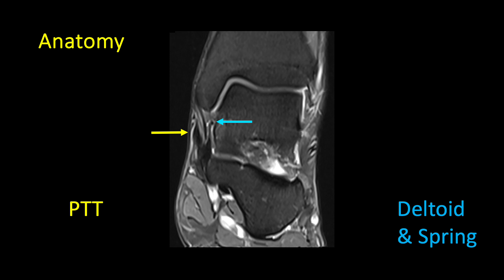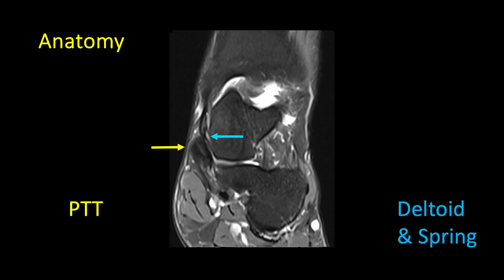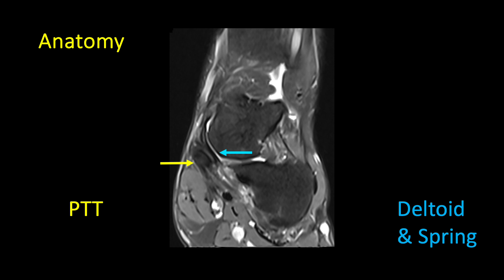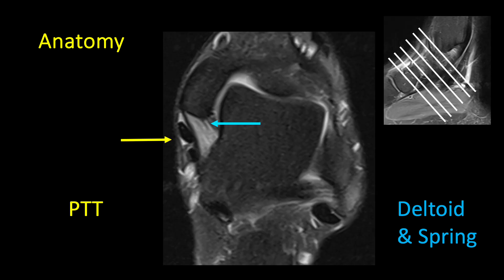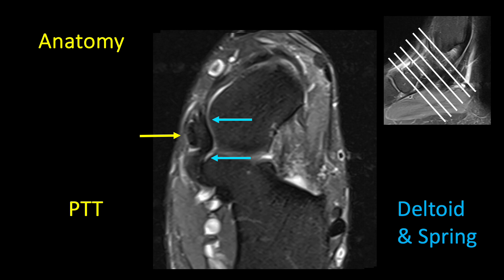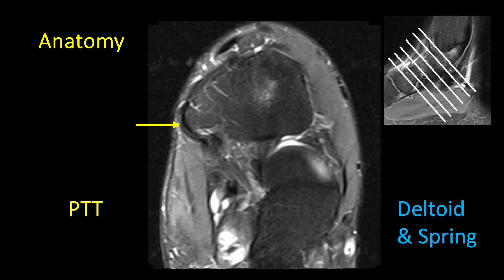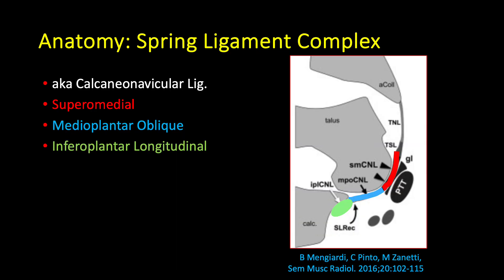Notice that the posterior tibial tendon remains superficial to the deltoid and spring ligament. We're now transitioning from the deep to the superficial deltoid, moving into the anterior components of the superficial deltoid, and here is a transition zone between the superficial deltoid ligament complex and the spring ligament, which is located deep to the posterior tibialis. Now rewinding in the oblique axial plane, starting at the ankle, we see the deep deltoid ligament deep to the posterior tibial tendon. Moving progressively anteriorly and inferiorly, approaching the navicular insertion of the posterior tibialis, we see the additional plantar slips of the spring ligament, and finally the posterior tibial insertion onto the medial pole navicular.